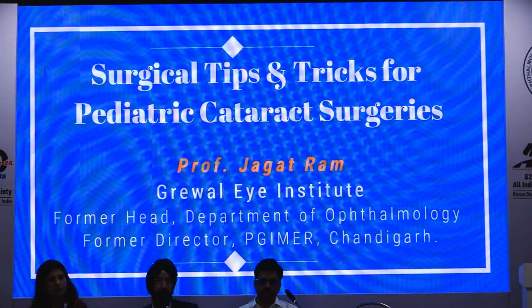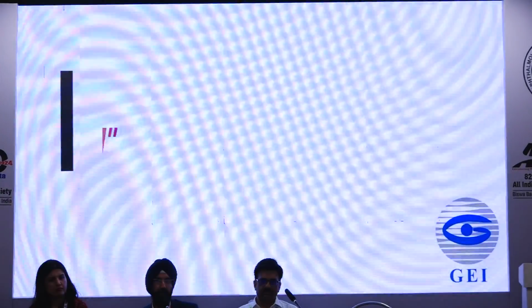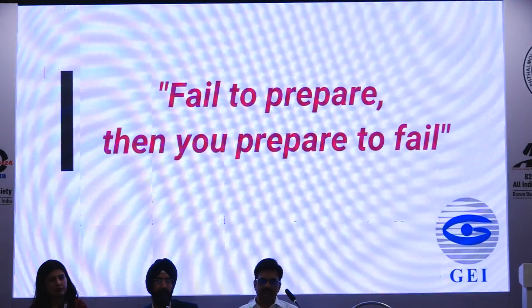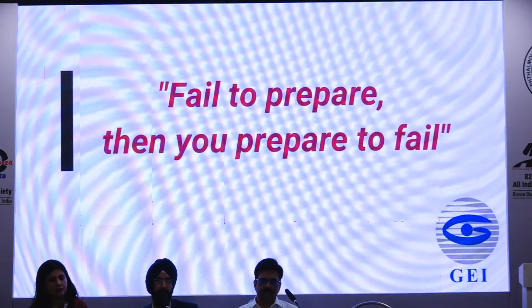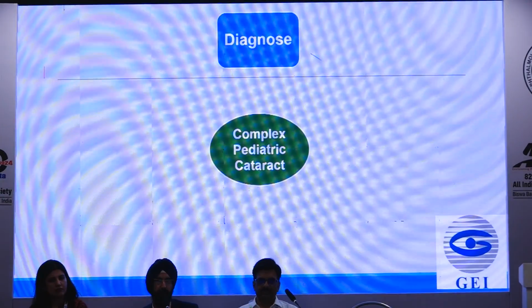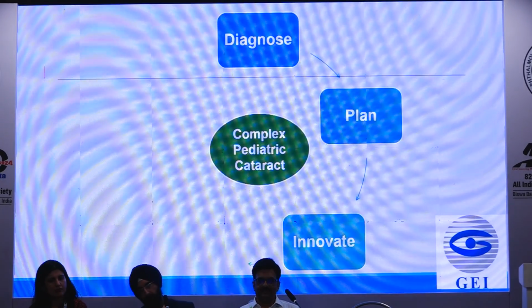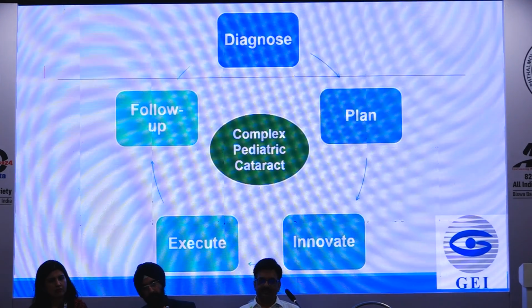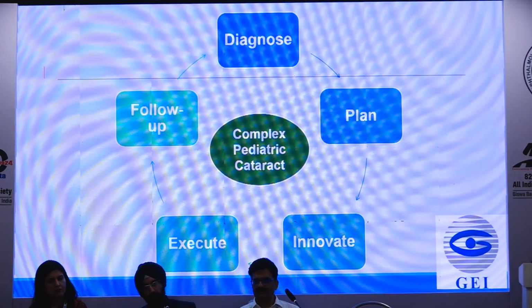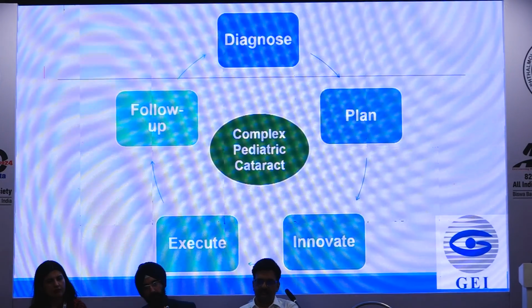So I think first is just a small simple video. In a more complex pediatric cataract, we have to diagnose, then plan what type of surgery, innovate, sometimes execute, and I think extremely important is follow-up of these children.